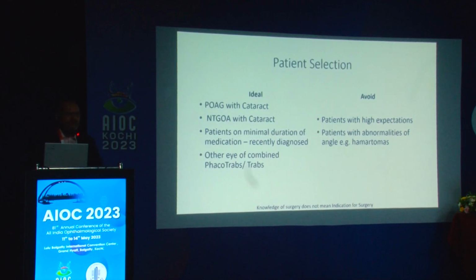Even patients with glaucomatous optic atrophy, near total glaucomatous optic atrophy, the idea is that you can reduce the intraocular pressure transiently, and then you can plan for your subsequent surgery later. So the prognosis is really very poor, and because it's a closed globe procedure, there's not any prolonged hypotony. These eyes do pretty well compared to a trab done in these eyes.